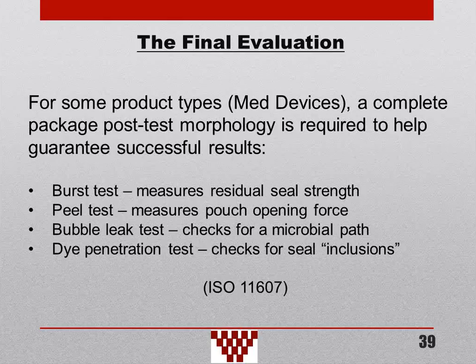Also, remember, for some devices, I'm going to pick on medical devices here, after the package is tested, you can do what's referred to as a post-test morphology. Anyone know what morphology is? I often ask that question, and I remember one student said, it's a study of morphs, of course. Well, no, it's actually the evaluation procedure, and it's required to help guarantee successful results. For example, in medical devices, we might do a burst test on a package after it's been through the distribution cycle in the laboratory, and it might be able to give you a pretty good idea of the residual strength. So it's an effort to say, how much do I have left, almost like a margin analysis.